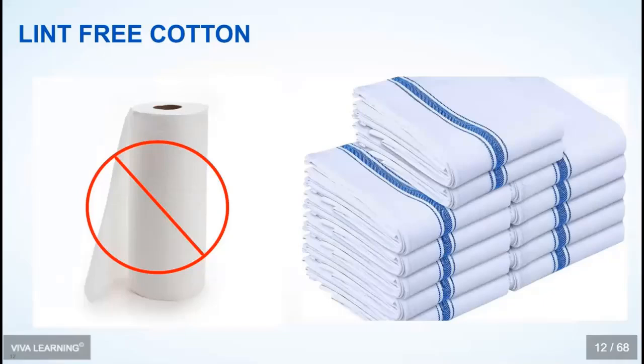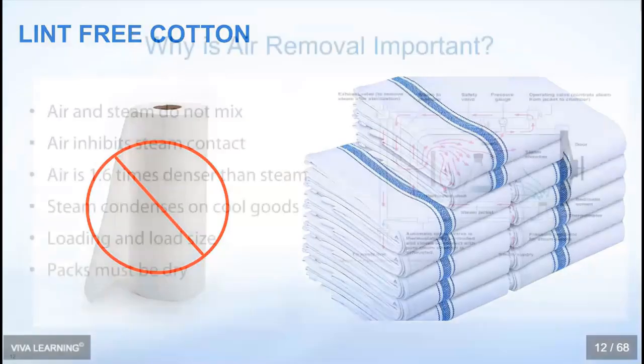There is a recommendation that when you are taking your instruments after you have put them through the ultrasonic and you've rinsed them, and now they have to be dried before you package them, you would be placing them on a non-linting or lint-free cotton. That means paper towels are not allowed. You can end up getting lint on the instruments, and then when you put it into the sterilizer, believe it or not, that lint can actually get out of the packaging into the steam, and it can cause clogging of the filters. So using absorbable, 100% cotton lint-free towels is what is recommended.